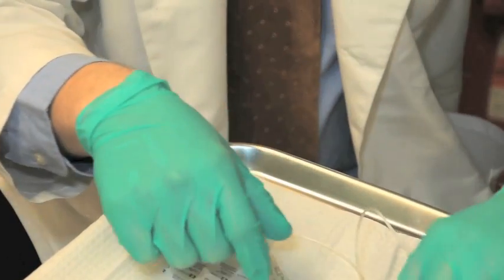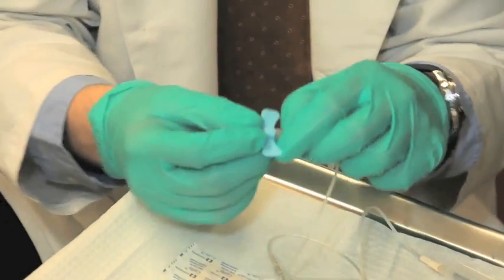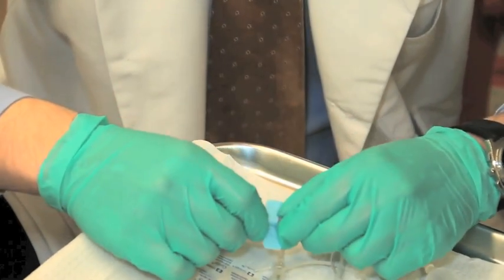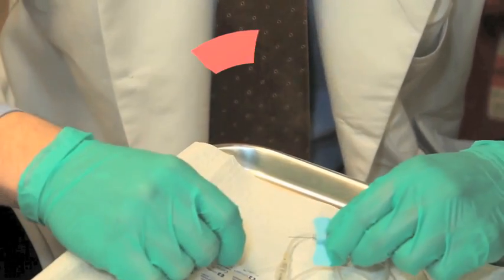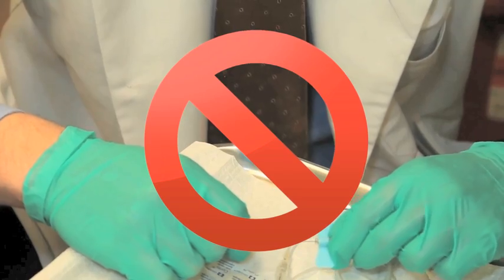If it does not come off readily, ask for help or discard the needle and try with another one. Avoid pulling the cap directly off the needle like this because a reflex can cause an accidental needle stick.